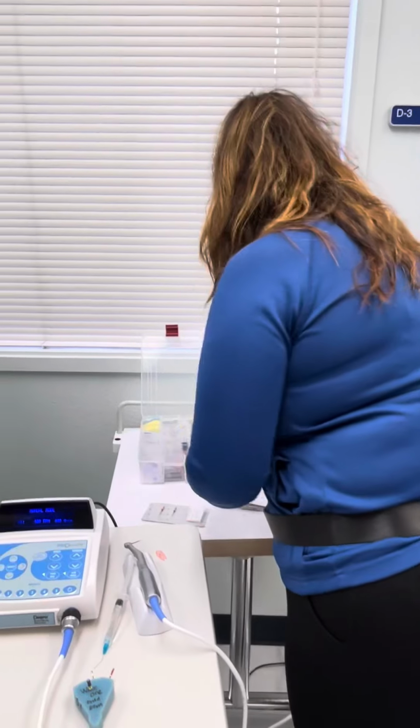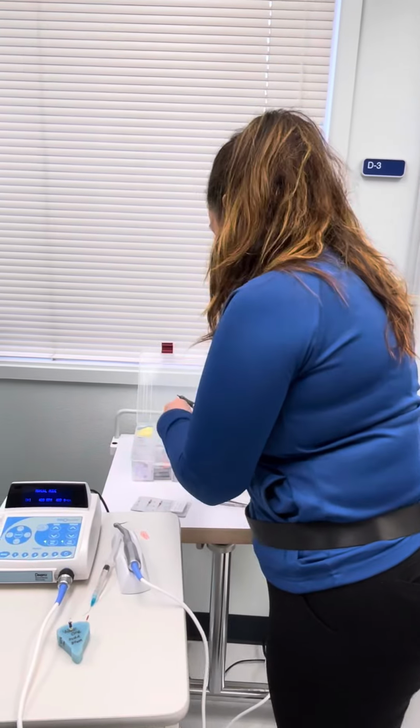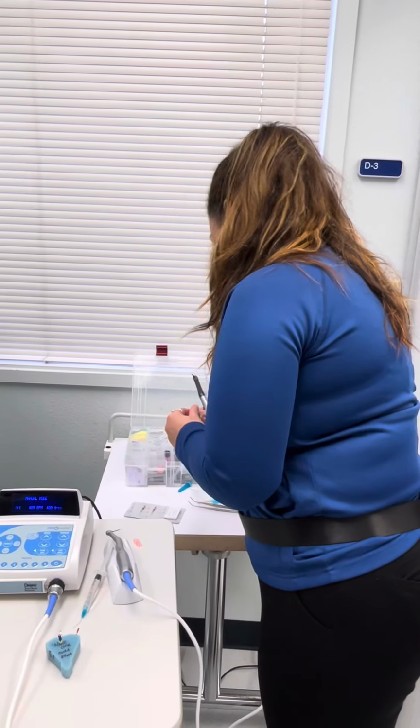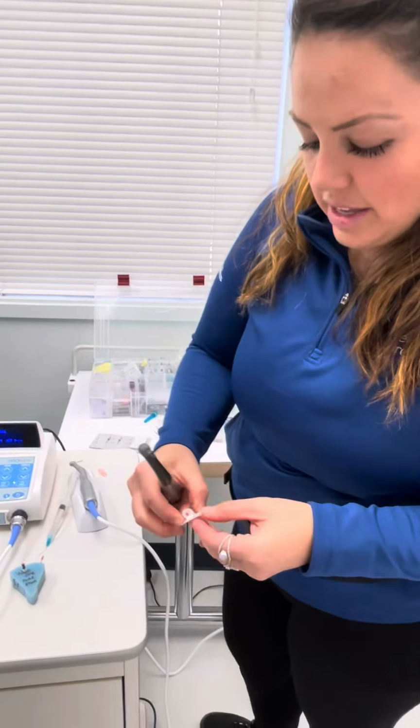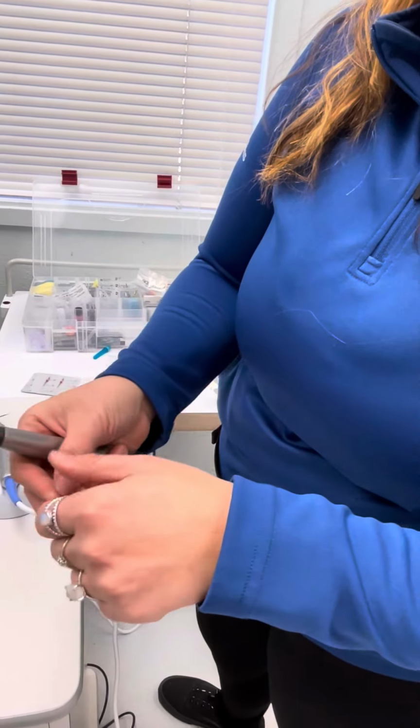Where did I hide my little tip for myself? Did we throw it away? These come in packages like this. I see it over here. Oh, do you? Yeah. Yeah, either way.